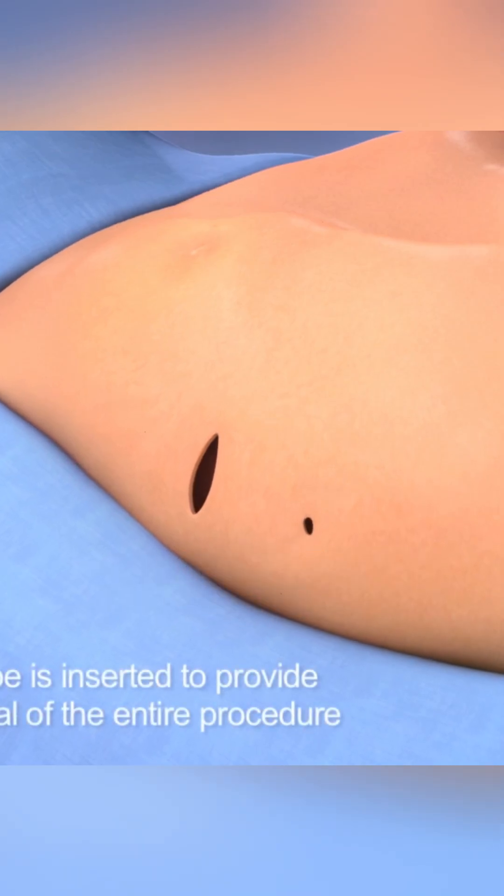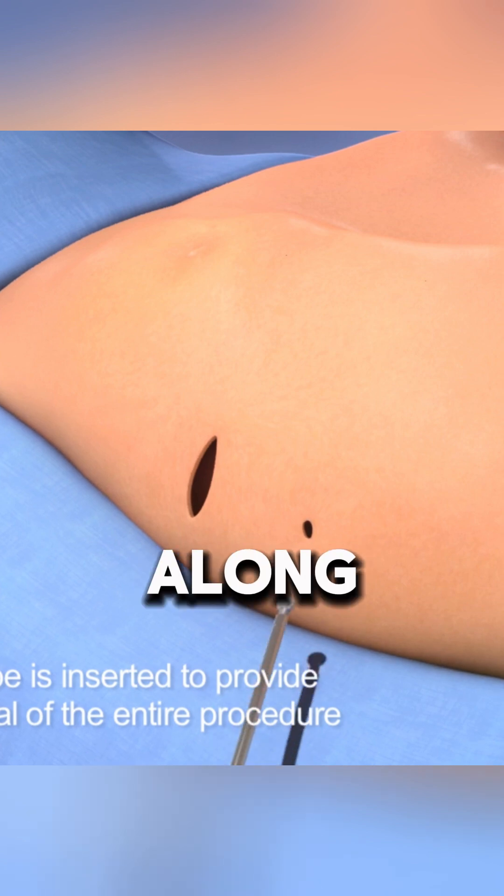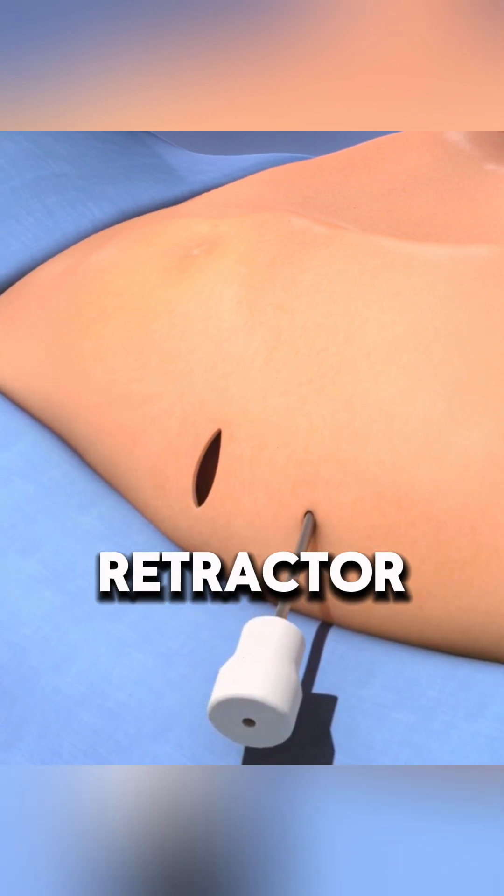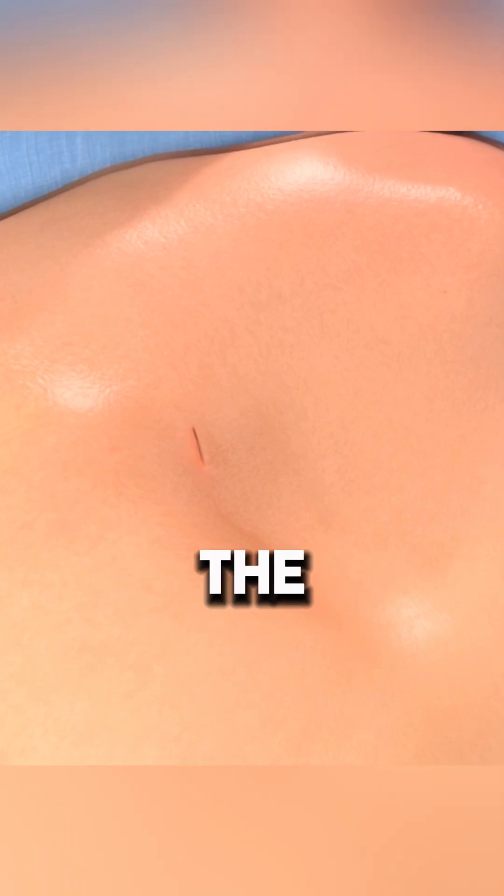Two small incisions are made on either side of the chest along with a small incision for a scope to guide the procedure. A retractor lifts the sternum away from the heart for safety.